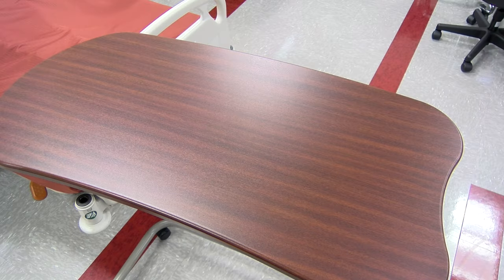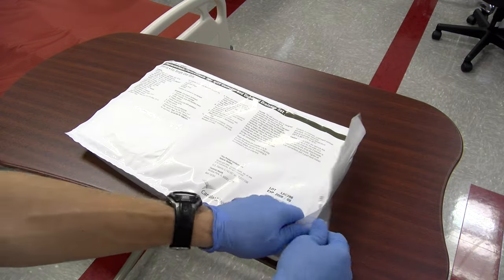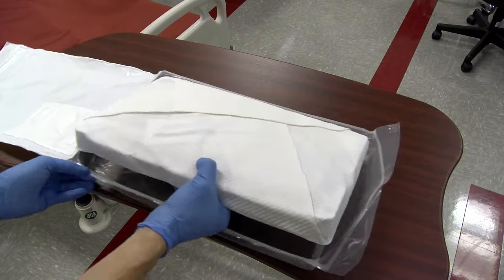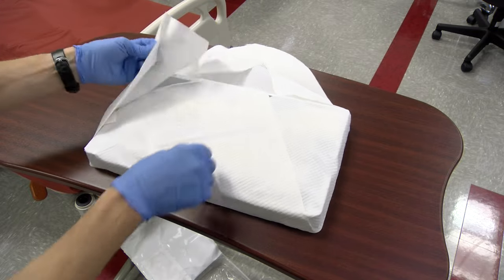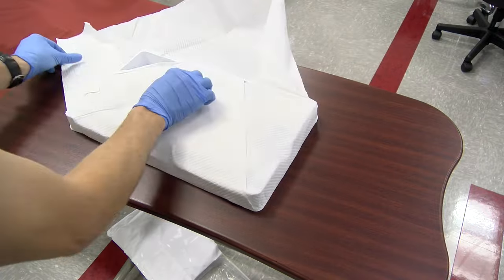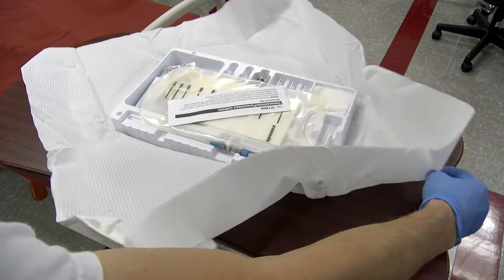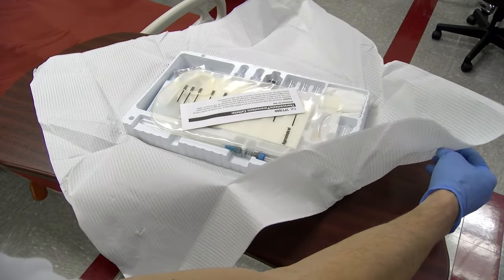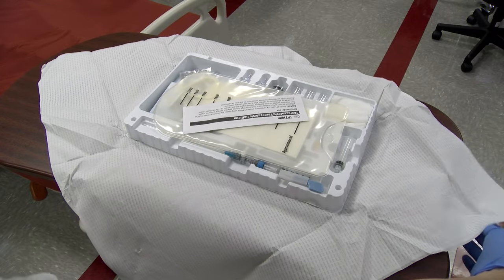A pre-prepared paracentesis kit should be available at most centers and include the following equipment: a 27-gauge needle and 18-gauge needle or filter needle to aspirate lidocaine, 1% lidocaine, 10 cc syringe, a catheter over needle introducer usually 6 to 8 French, an 11-blade scalpel, gauze, fluid sample collection tubes, and drainage tubing with 14-gauge needle and vacutainer, or one-way valve tubing and a 60 cc syringe used for drainage with the plastic bag.